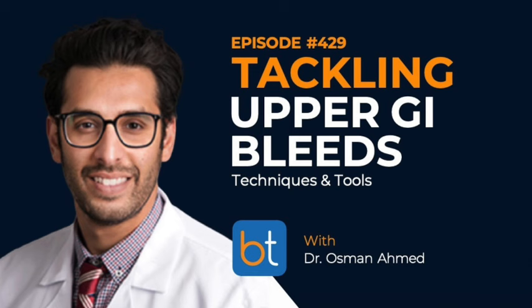Yeah, I've always thought that was interesting. Can you explain why, with the left gastric, we're willing to do something temporary like gel foam, versus the GDA, we tend to just coil it? Just for the trainees, what the difference is and why? Yeah, it's a great question. With the GDA, as we know, it's an anastomotic connection with branches from the SMA via the pancreatic arcade.